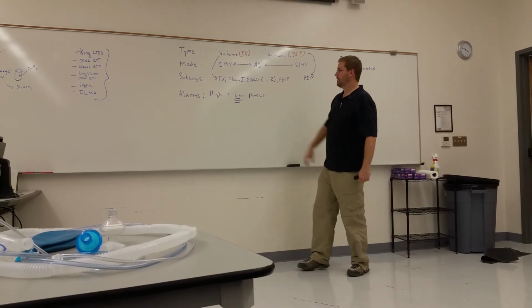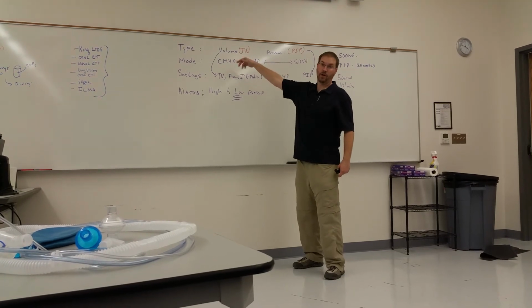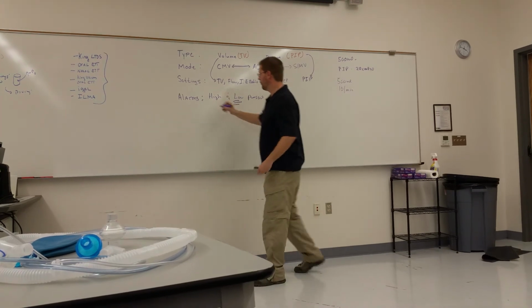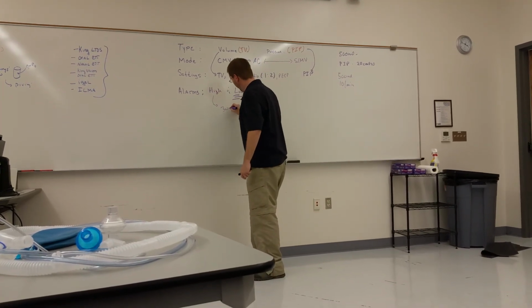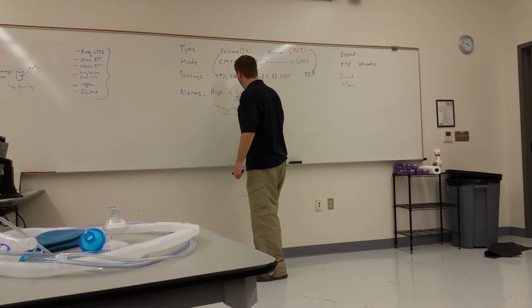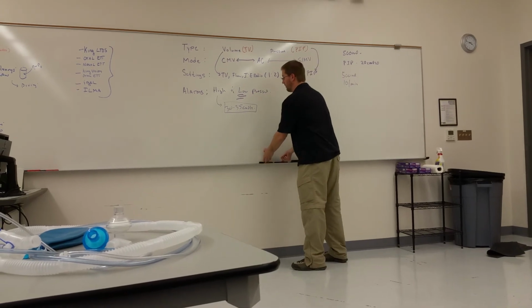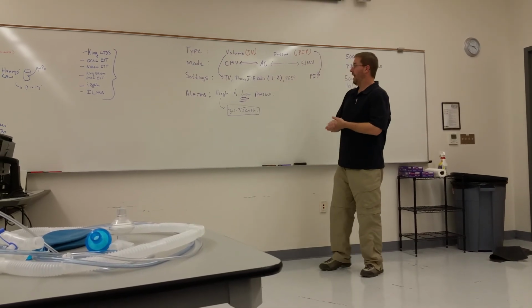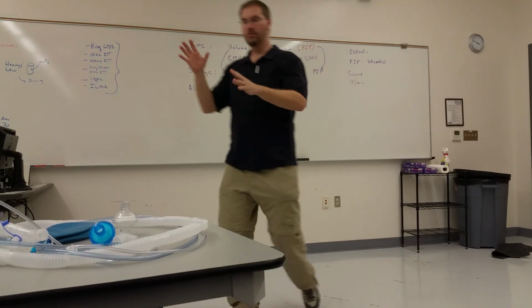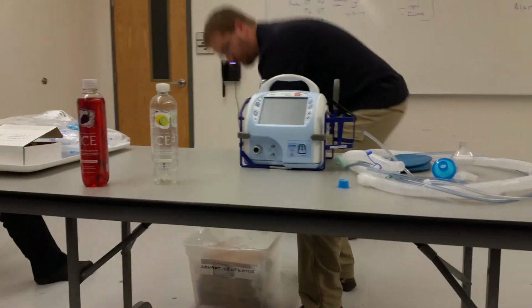Yes. High pressure is very important as well, particularly if you're in volume control, right? Because you want to know if the pressures in the airway are too high. And as a general rule of thumb, pressures higher than about 30 to 35 centimeters of water are going to be problematic. You'd be concerned if your pressures are consistently higher than that. Okay, that's your crash course. You guys okay there? So what I'm going to do is I'm just going to take you through a basic setup on this ventilator here.